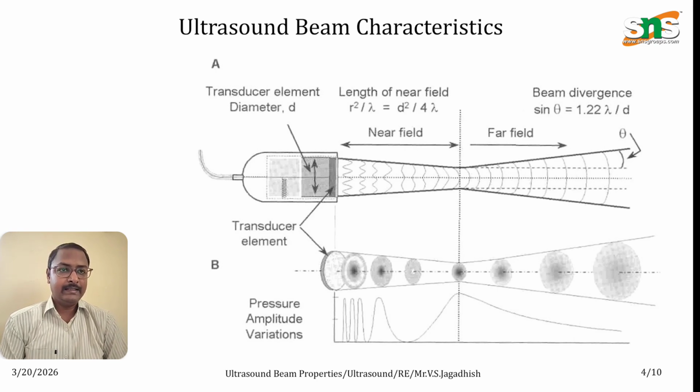Up to the near field, we can have good spatial resolution when acquiring images. If you want to use the same ultrasound transducer for therapy, where the application involves larger distance travel, we would prefer the far field.